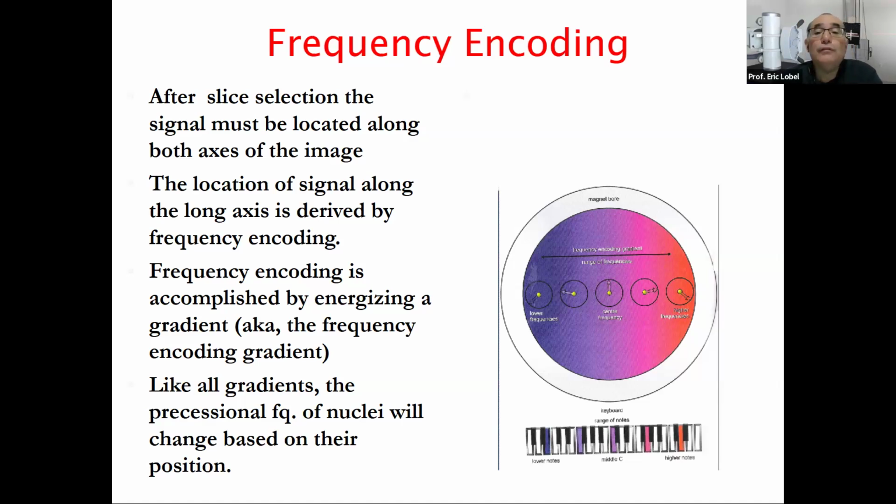The frequency encoding works the same way, right? It works with slope. However, it's going to determine two things. One, essentially what we're scanning, the field of view, but more importantly, the bandwidth. So if we remember, when it comes to bandwidth, there are two types of bandwidth. There is the transmit bandwidth, what we send with our initial RF, that's our excitation pulse. And then this is the more important one when it comes to frequency encoding, we have the receiver bandwidth.